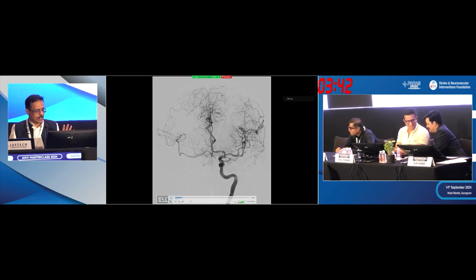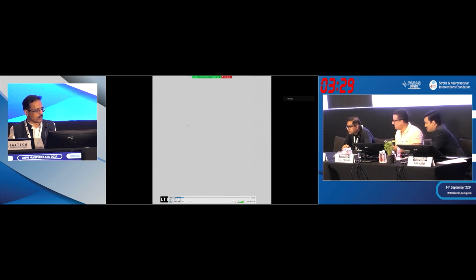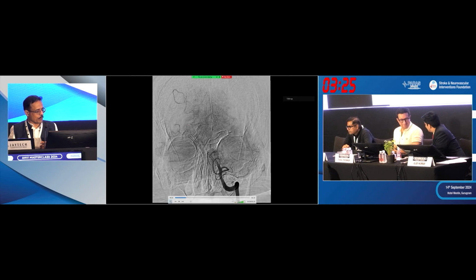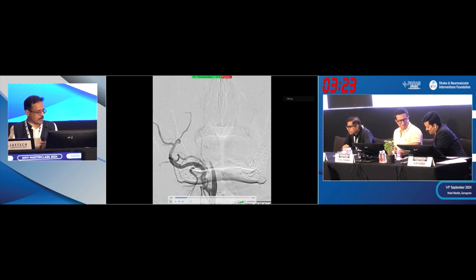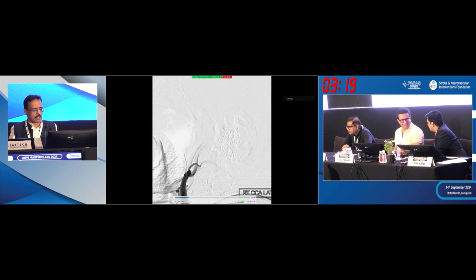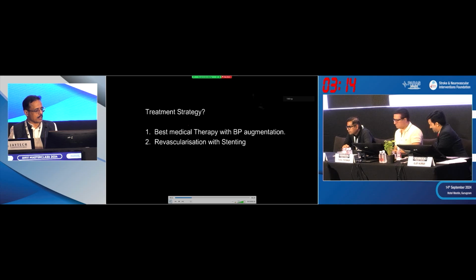Okay, so this is another patient, a fluctuating patient. Again, we took a contralateral injection, so some watershed infarctions. And there is an ACOM here, but it doesn't look that great. Okay, this is the key here. You can see some delay on the right side. And he was fluctuating. We tried to keep him conservative. We checked for the PCOM quickly. Again, some leptomeningeal collaterals. And this looks like, okay, this is what dissection would look like. ICA tapered off, narrowing, what we used to call a rat-tail appearance.